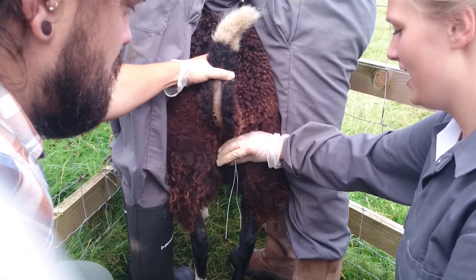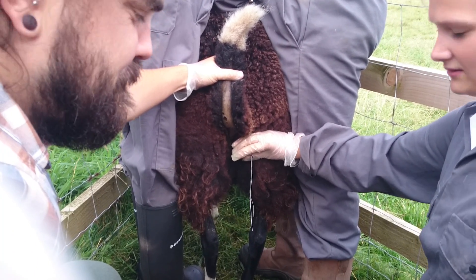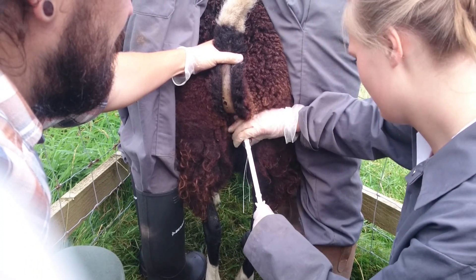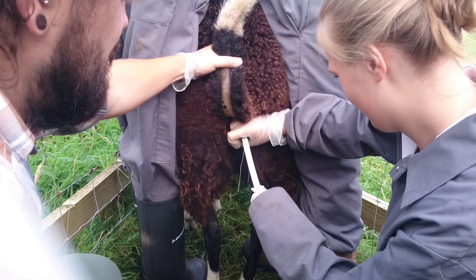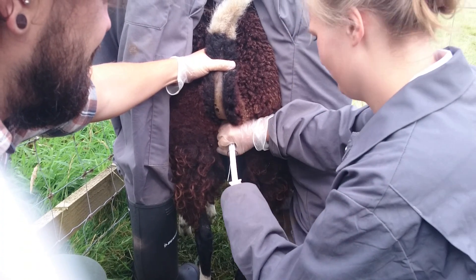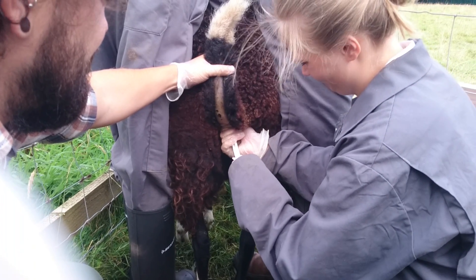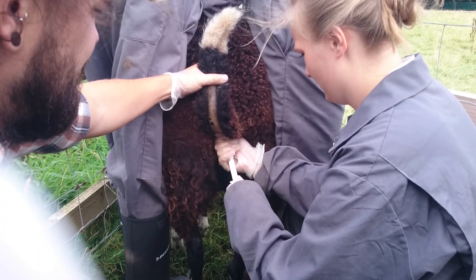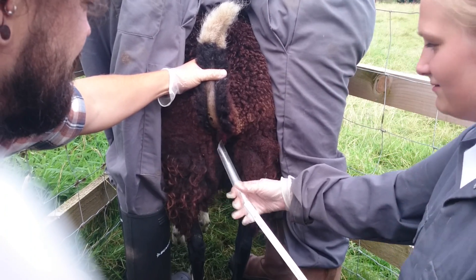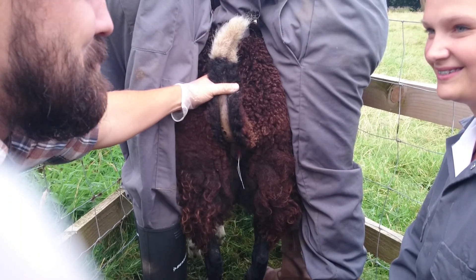What's that string for? So when we're finished we can easily just pull it out. Now we're just using this to put it in. Perfect. That's a well sponged tube.